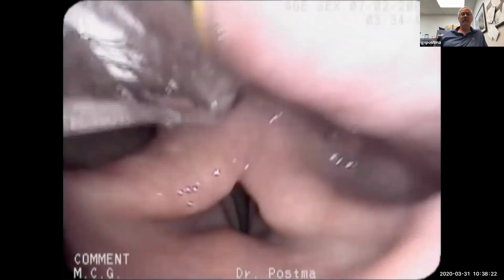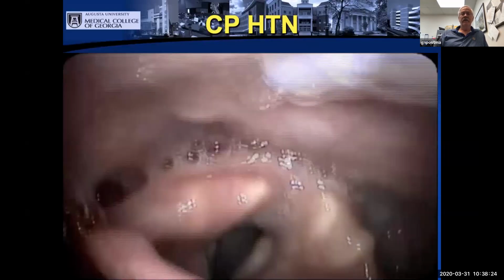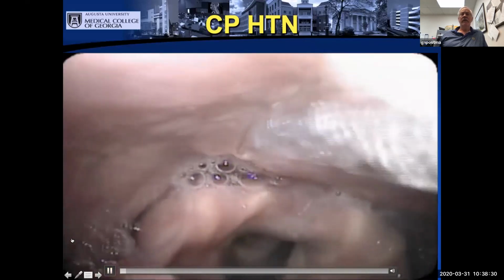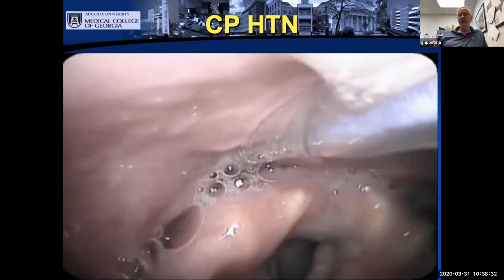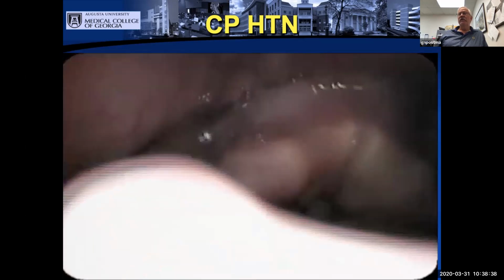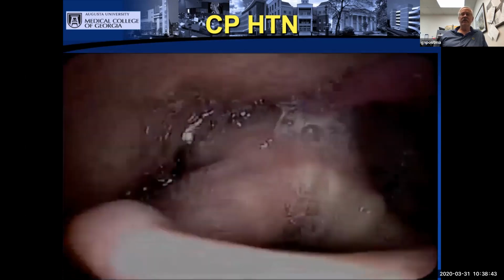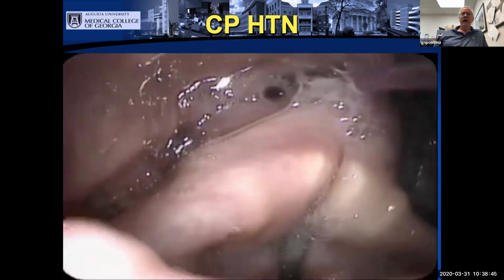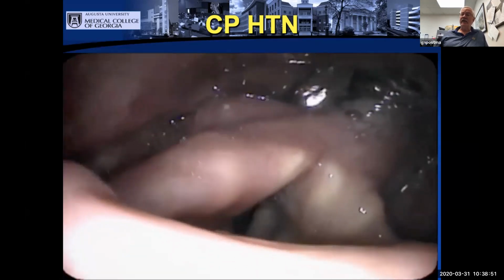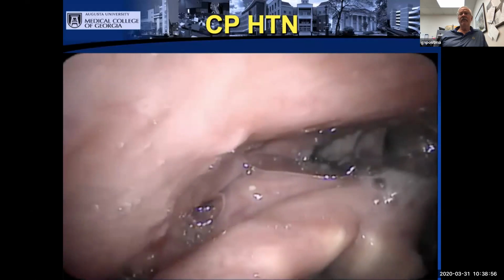If you do the cricopharyngeus, once again, you keep this thing under direct view, and no magic. Another one with the balloon, not inflated, thankfully. We've used this for, like I said, cricopharyngeus dysfunction, hypopharyngeal esophageal strictures, strictures after laryngectomy particularly, a handful of people with gastric pull-ups after having esophagectomies. You can easily dilate with this. And once again, remarkably well tolerated.